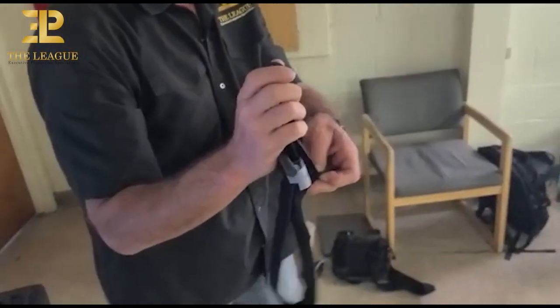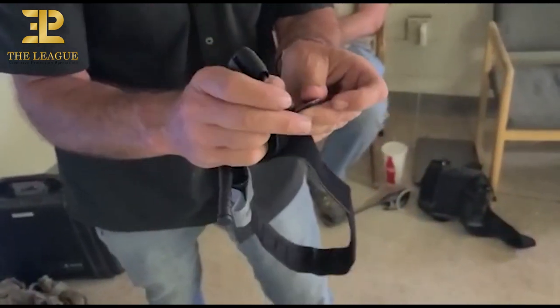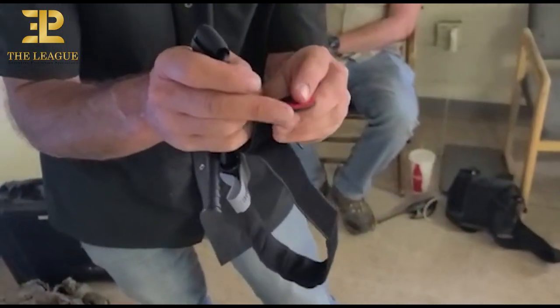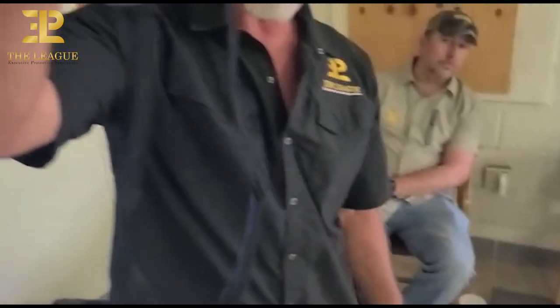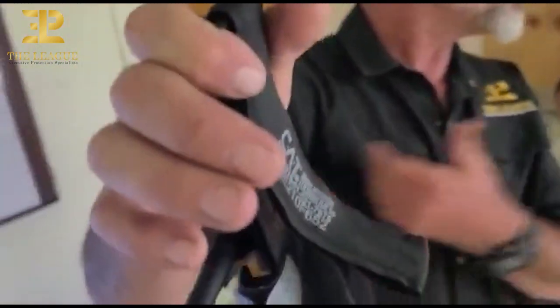We talked about the reinforced piece of plastic in the red tab. Find that and bend it back on itself. That way, you have a readily identifiable tab. Once you deploy this thing, you're going to grab and pull it in.